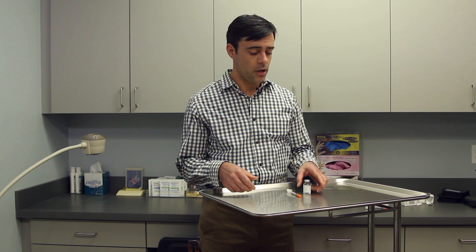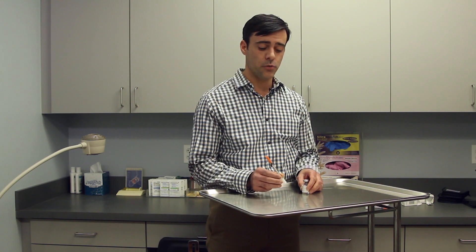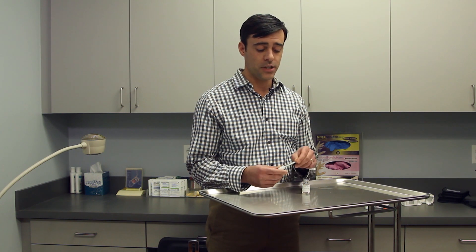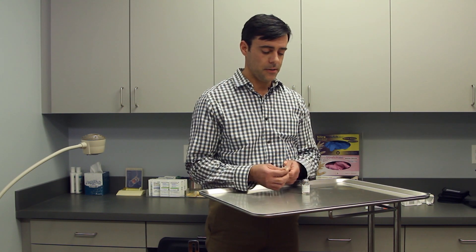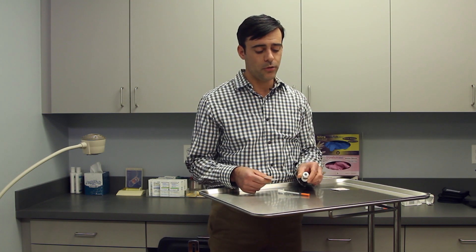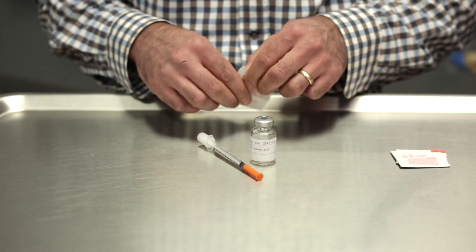Today we're going to talk about how to do an intracavernosal or penile injection. You'll need your bottle of medication and your syringe, which you should have received from your local pharmacy. We use an insulin syringe. You'll also need some alcohol swabs, which are used to clean off the rubber stopper on top of your bottle of medication.